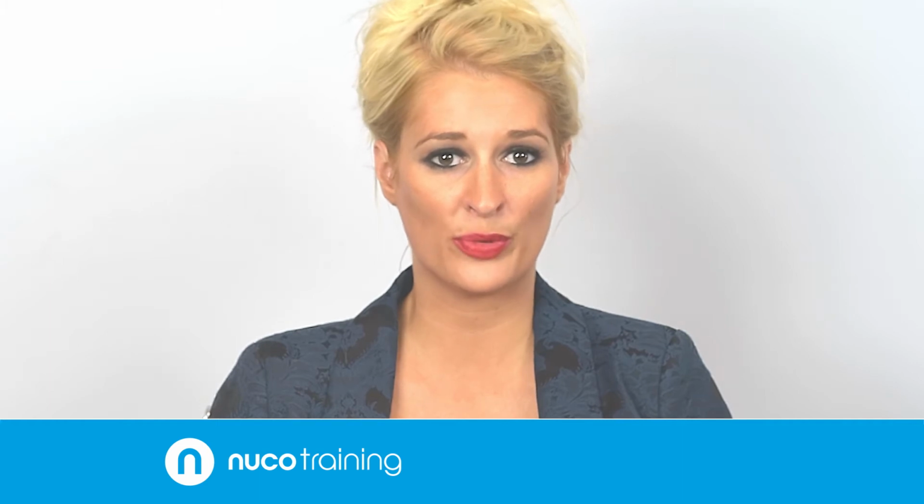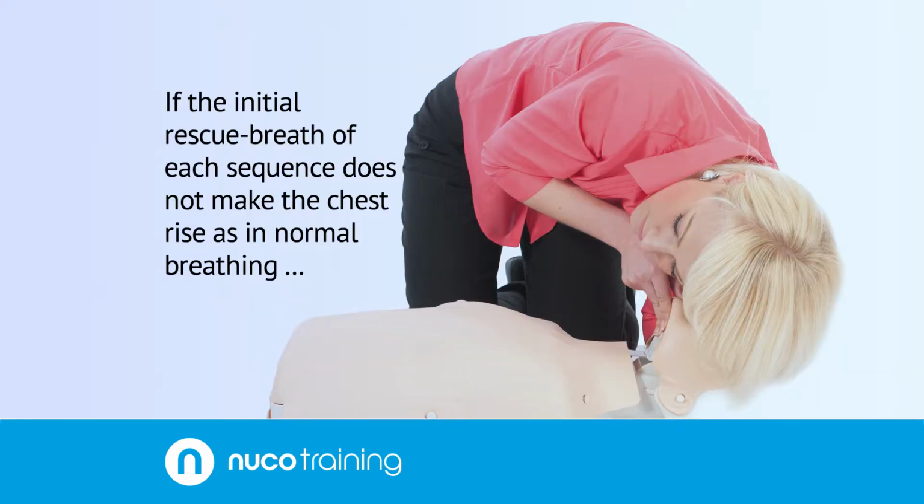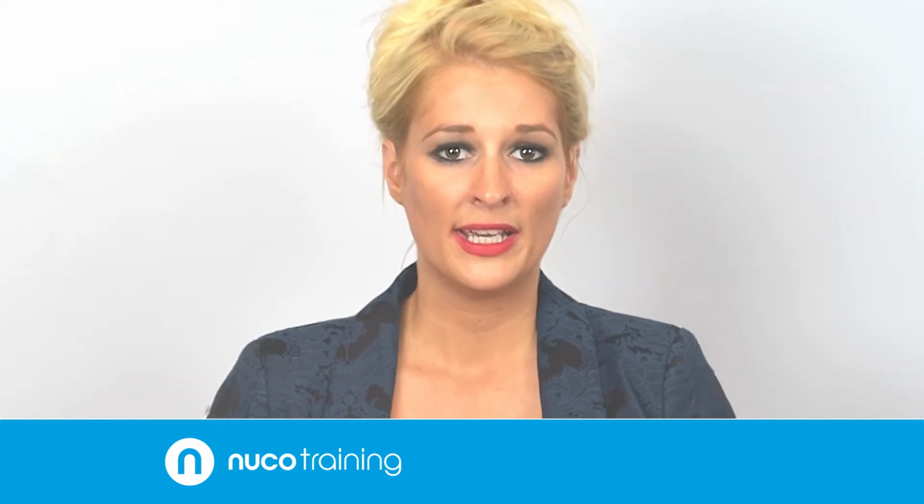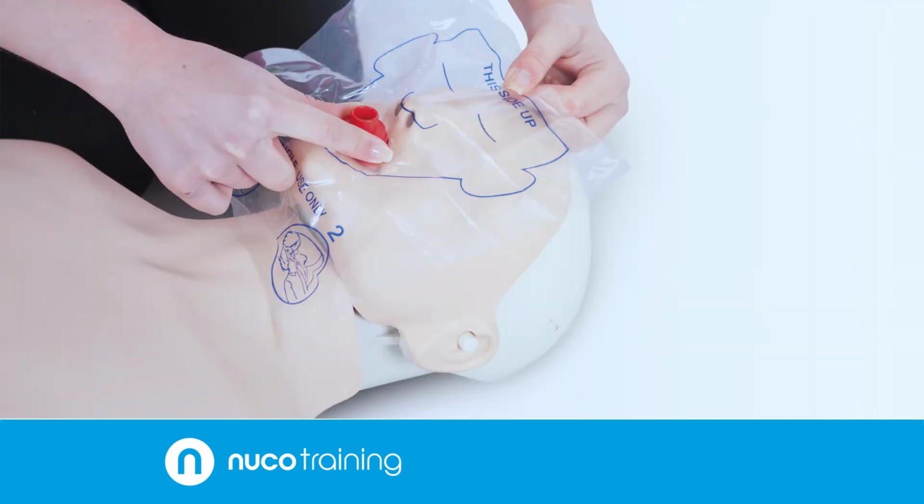Do not interrupt compressions by more than 10 seconds to deliver both breaths. If the initial rescue breath of each sequence does not make the chest rise as in normal breathing, then, before your next attempt, check the casualty's mouth and remove any visible obstruction. Check that there is adequate head tilt and chin lift. Do not attempt more than 2 breaths each time before returning to chest compression. In order to reduce the risk of cross-contamination when giving rescue breaths, there are various protective shields and masks available that will significantly reduce this risk.